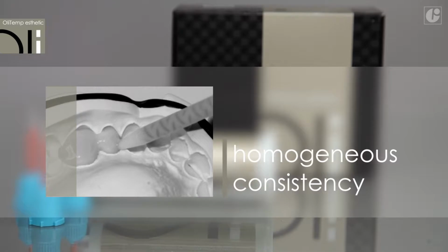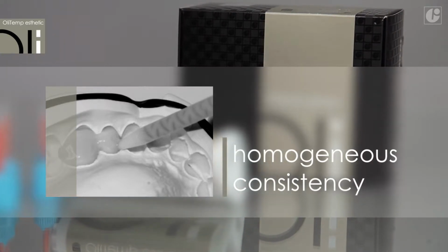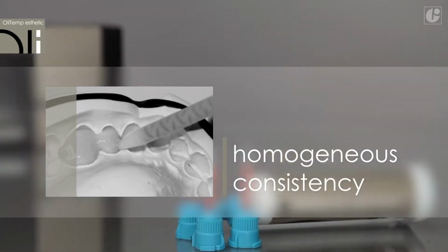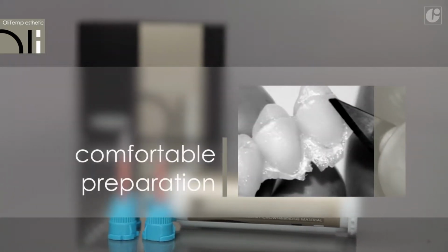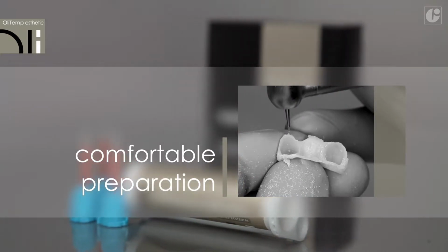Due to automatic mixing, OliTemp Aesthetic always provides homogeneous consistency without any air bubbles that could cause cracks. It is good chemically to allow control of individual phases. In the elastic phase, easy removal from the oral cavity and pre-treatment with a scalpel. In the polymerized phase, preparation with rotary tools.